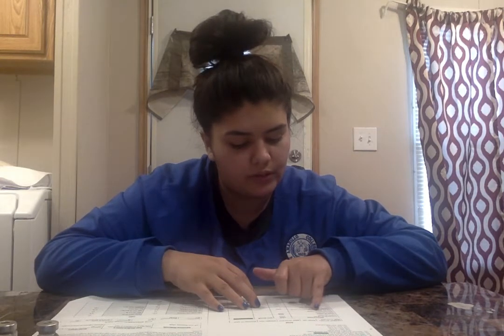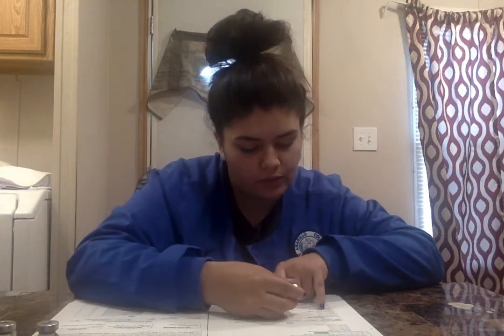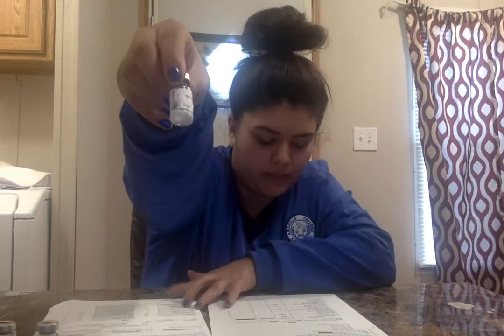Next, we're going to have hydromorphone, 2 mg intramuscularly. Available, we have 2 mg per milliliter. We're supposed to give 1 milliliter intramuscularly every 4 to 6 hours as needed for left foot pain. We're going to grab our hydromorphone, 2 mg per milliliter. This expires 5/26 2020, and that is the right medication.